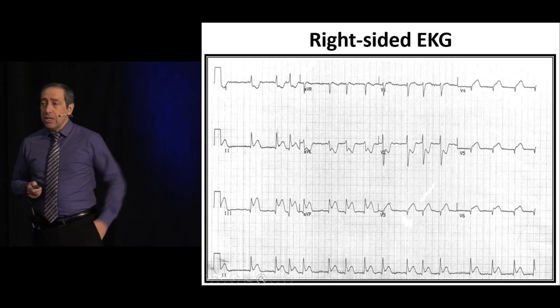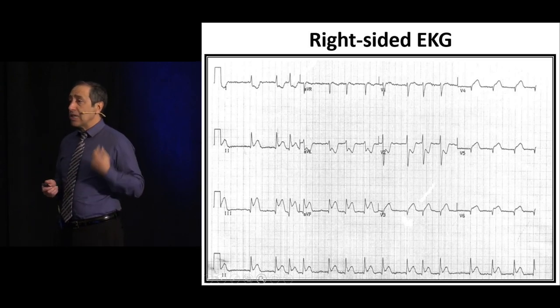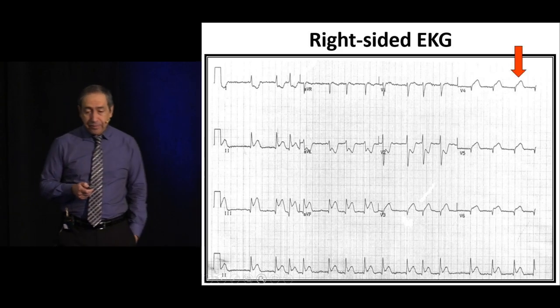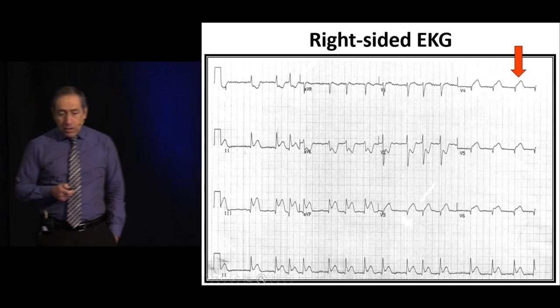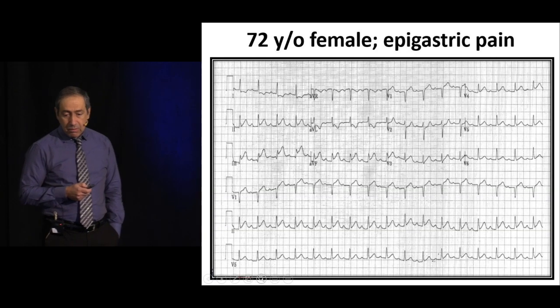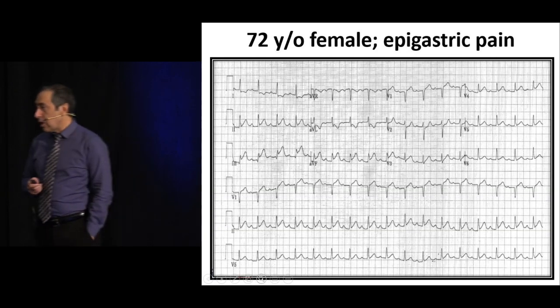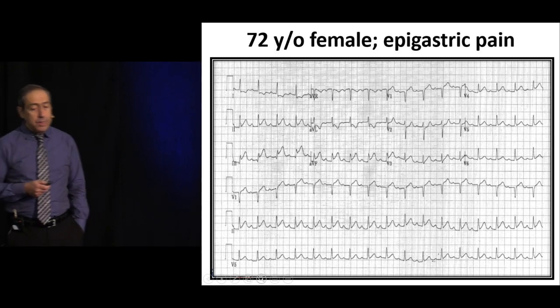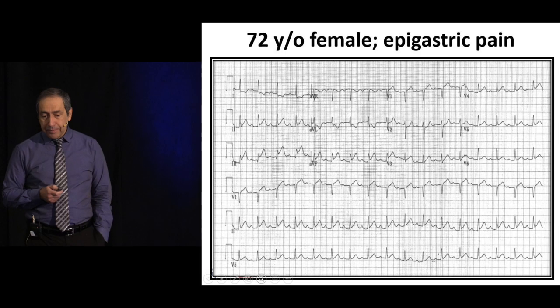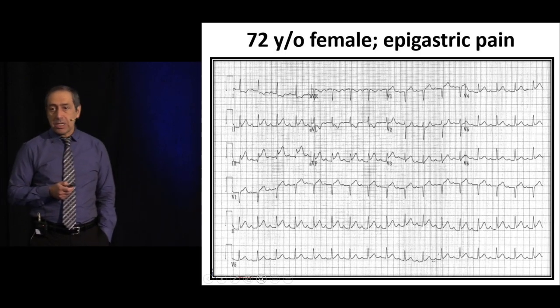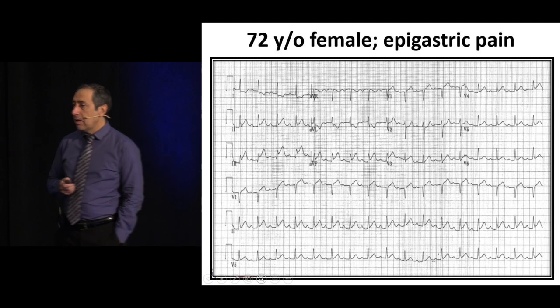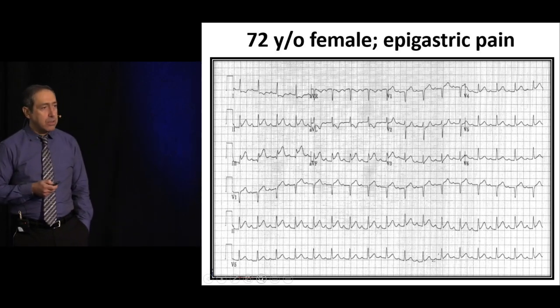Here is our right-sided EKG. Remember, we're not going to remove the original sticker — just take a new sticker and put it on the other side, fifth intercostal space, mid-clavicular line. Now, this is a good EKG example of what you've learned. Do we have ST elevations in the inferior leads? We do — ST elevations in leads 2, 3, and AVF. Do we have reciprocal changes in AVL? Yes. So this is inferior myocardial infarction.